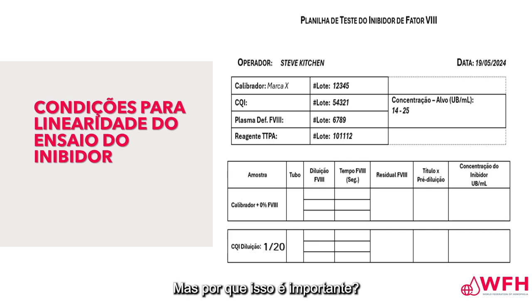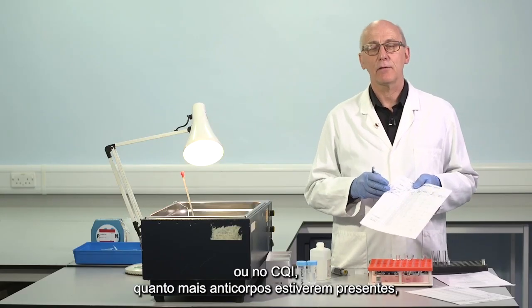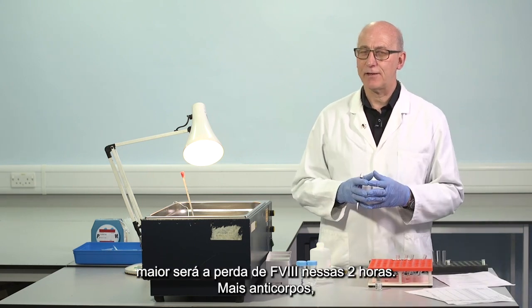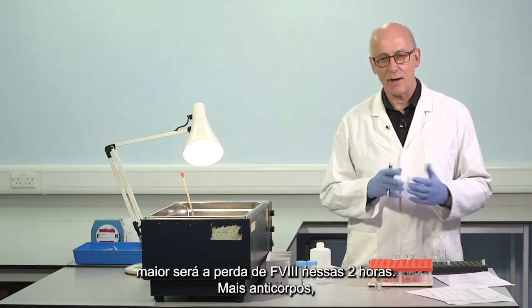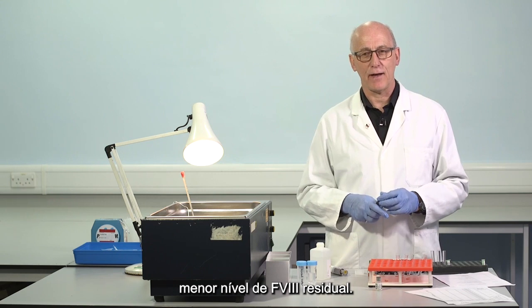Why do we need to do that? Why is that important? It's essential because the more antibody that's present in the patient sample, or the IQC, the greater will be the loss of factor VIII over that 2 hours. More antibody, more destruction, more loss. A lower level of residual factor VIII.